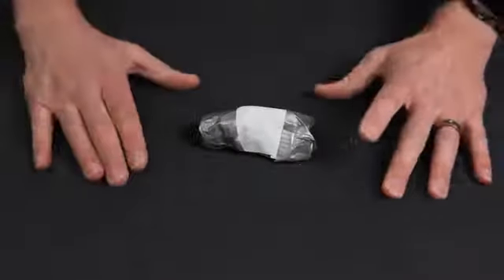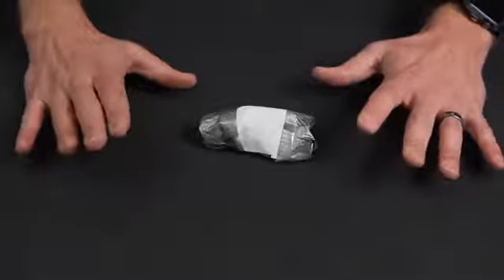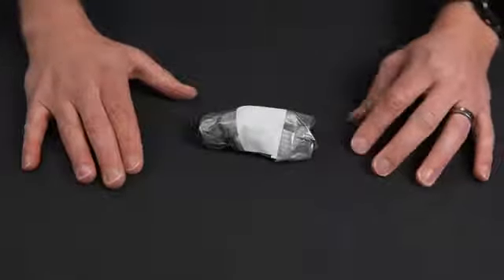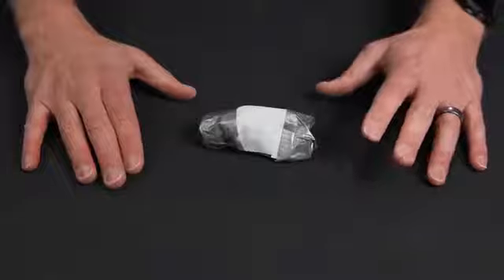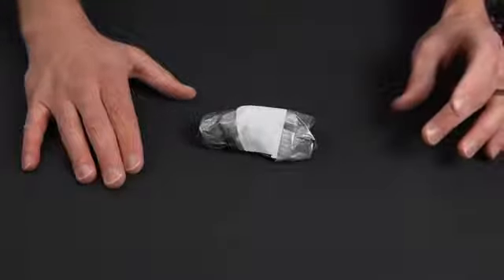All right, so the second technique is a simpler version of the first one, and this is actually how I was trained to perform this procedure on the helicopter. It is slightly more controversial though. So for this technique, it starts the same. We want to position ourselves on whatever side of the patient we are dominant. So if I'm right-hand dominant, I'm going to be on the right side of the patient.